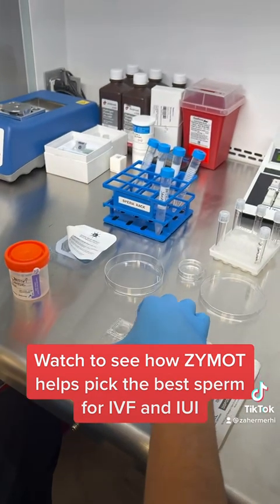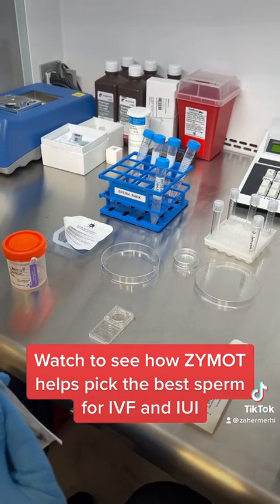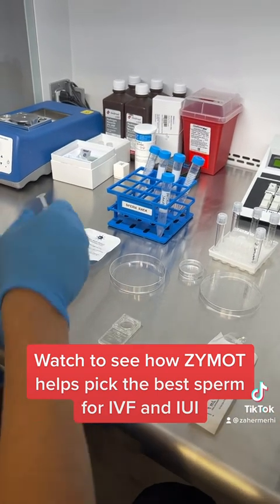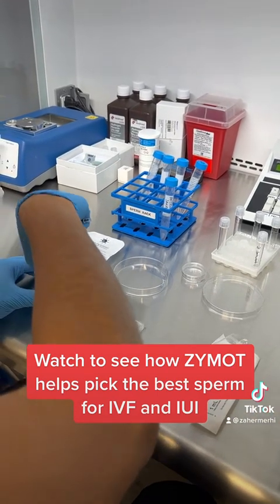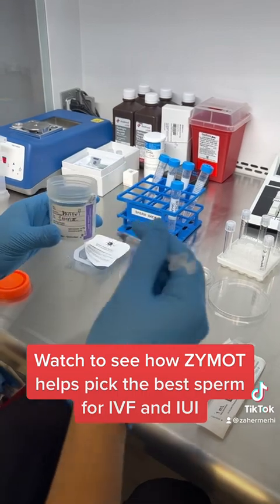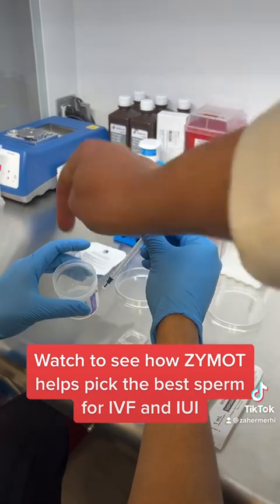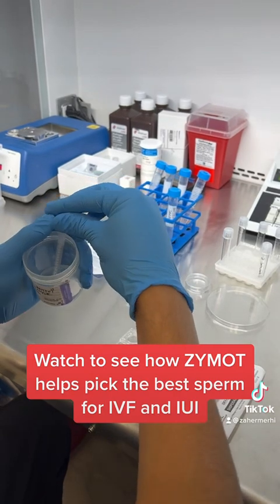That's not a sperm — this is just the solution that Anthony is going to be using, representing the patient sample. The man produces sperm in a cup, then we take some of that sperm to begin the process.